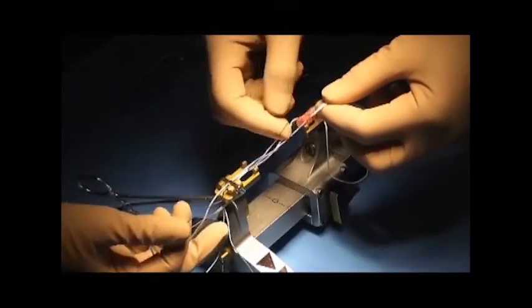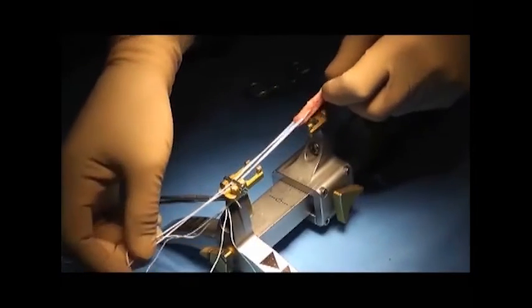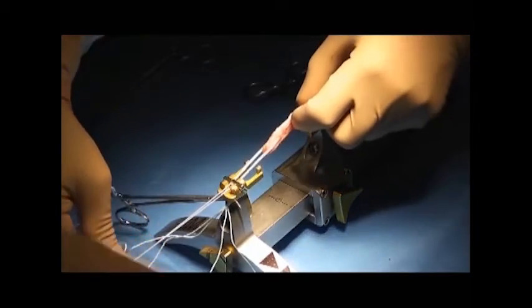Once the temporary black loop enters the splice, pull harder while holding the rest of the construct until a click is heard, and make the braided suture exit the button plate in order to make the second splice. Adjust the size of the pull-up BTB loops.